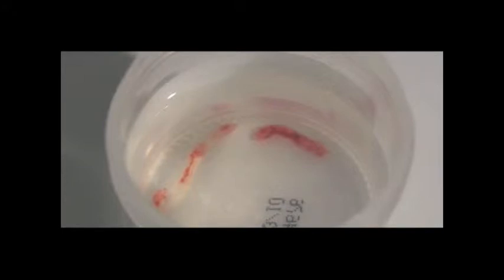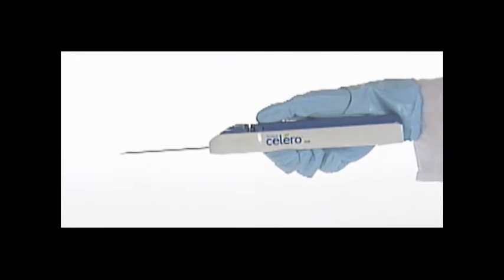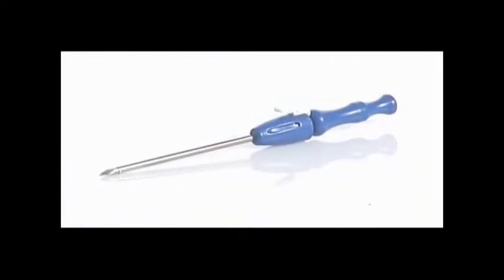Fewer needle insertions offer a more compassionate breast biopsy for your patient and more efficiency for your practice. This video demonstrates the Suros Celero with the optional introducer set.